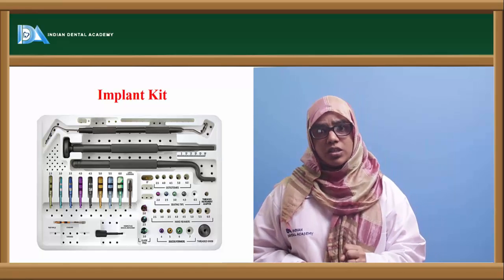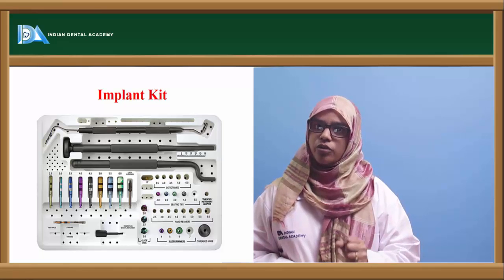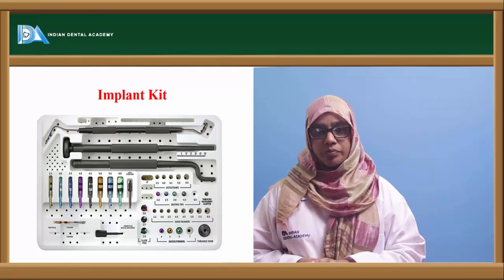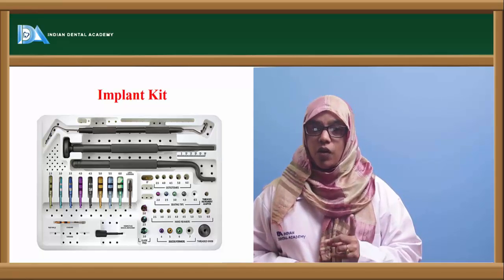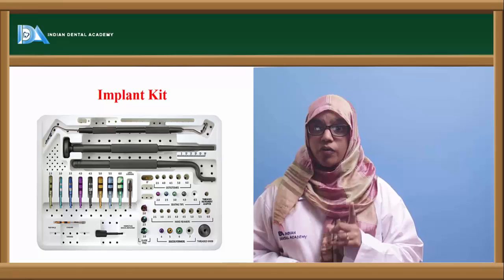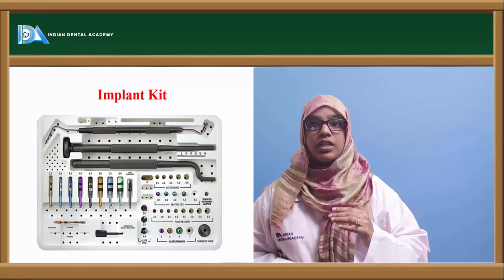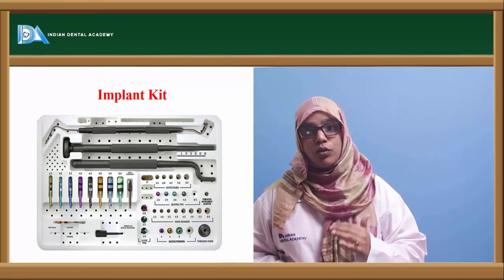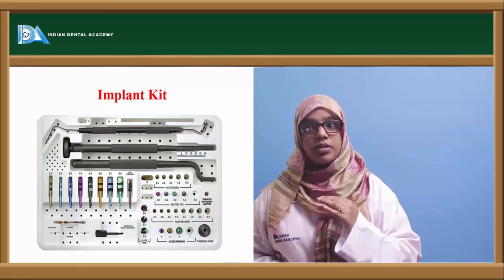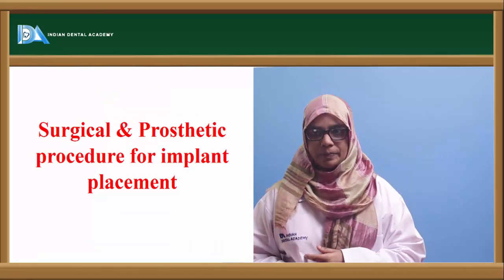If the bone is very soft, just a 3.5 diameter drill is sufficient, and then you can just do condensation of the bone. There are instruments available for condensation of the bone, or packing of the bone, used to condense the bone into the sinus cavity. In sinus lift procedures, if you have to do an indirect sinus lift, there are instruments available with which you can pack the bone inside the sinus.